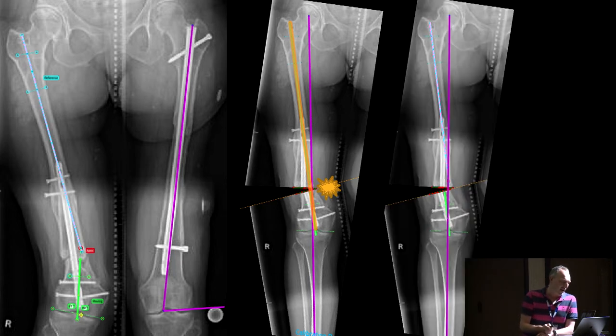I played around with the software a little bit, and by translating the osteotomy a little bit laterally, I thought there was a possibility that we'd be able to introduce the nail and get an acceptable position. And when we replanned and redrew a mechanical axis, with that it'll result in a slight undercorrection, it still appeared reasonable. It's important to note she does actually have some valgus on the other side from her other injury. And I also was keen to avoid creating a sort of windswept appearance. So I wasn't too worried if I undercorrected her a little bit at this point.